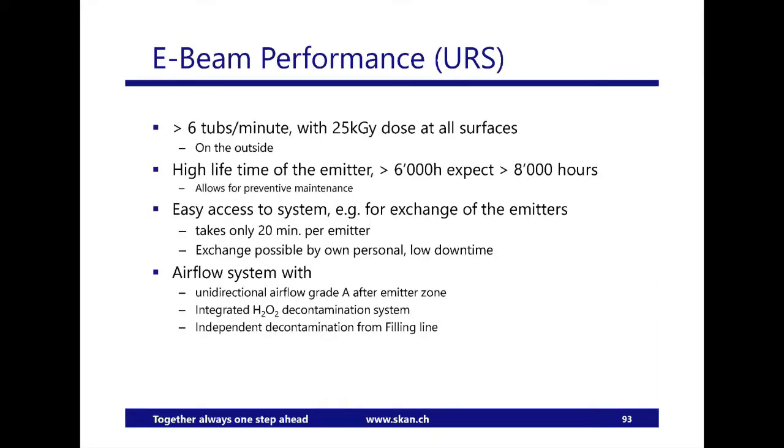So the summary is, the regulation calls for a sterilization dose of 25 kilogray, which will be applied and verified. This is the industry standard, and achieving it is no issue at all with today's emitter technology, and dosimetry for the validation is sufficient. No BIs necessary.